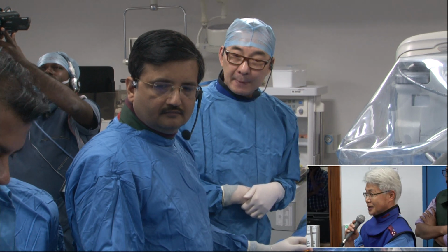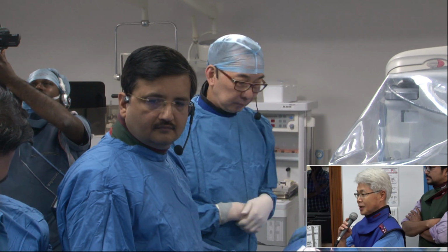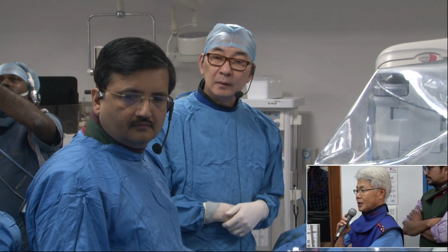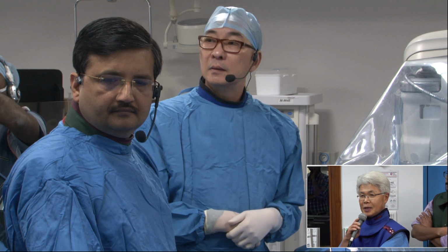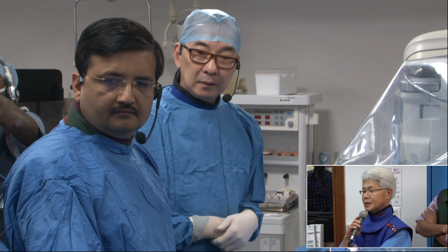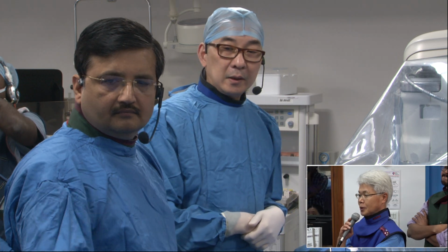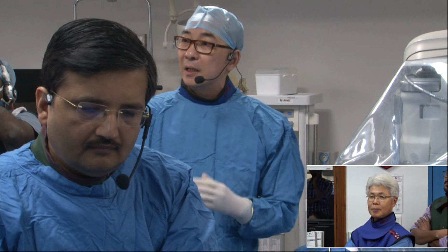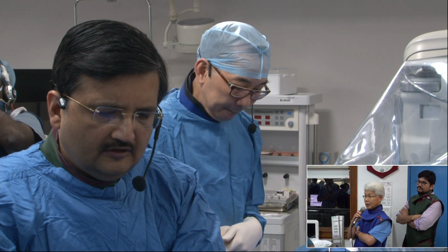The importance of imaging guidance is to obtain the optimal result. Even in the Ultimate study, they compared optimal and suboptimal results, and there was a significant difference in long-term prognosis. So it is important to obtain the optimal result, regardless of OCT or IVUS. What do you think? I agree.